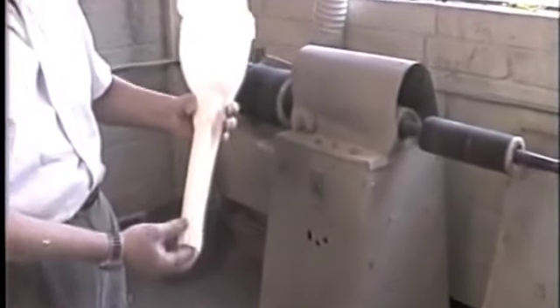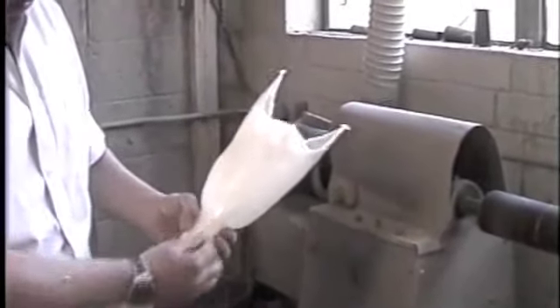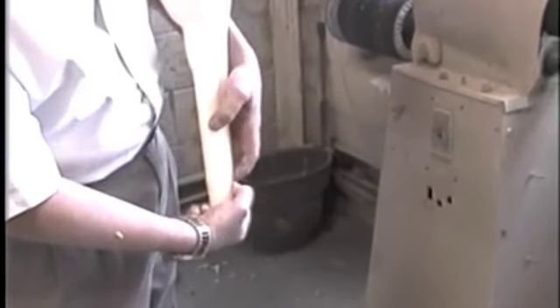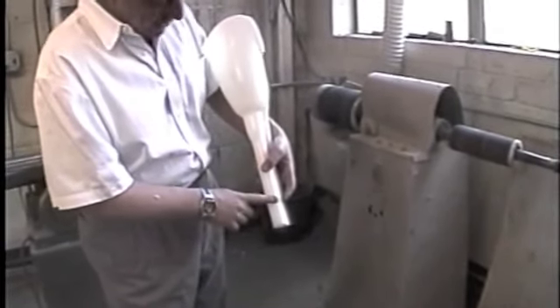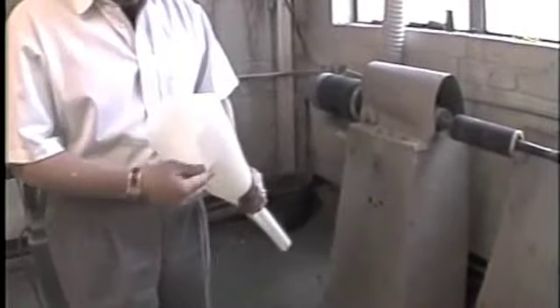Now, if he was a more active patient, we would probably leave more of the seam on in the beginning, so that would leave us that extra meat to shave off during the fitting stages. And that's the way you want to do it. Always gradual, smooth transitions. If your foot clamp terminates here, you don't want to have your plastic full thickness and then zip right into the foot clamp, because then you're depending on just this one little location for any flexibility. You're making the whole pylon so rigid that it's going to put a tremendous amount of stress on the pylon in this area, and it'll fail. Even if you want it stiff, you have to gradually taper the seam out. Okay, this is ready to polish and assemble.